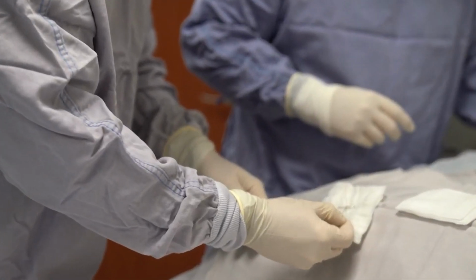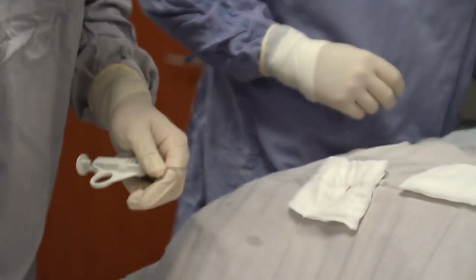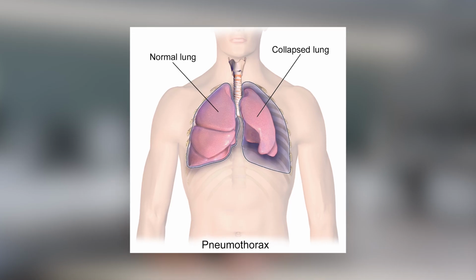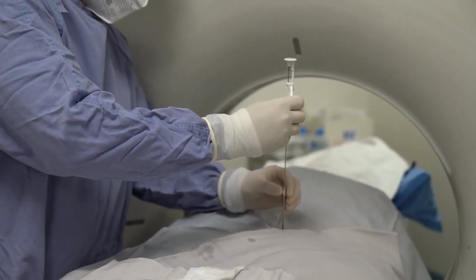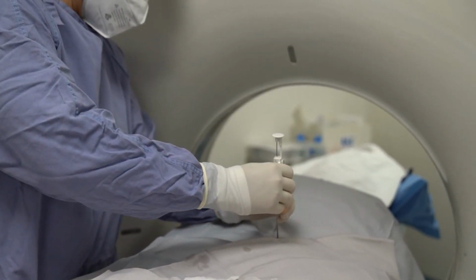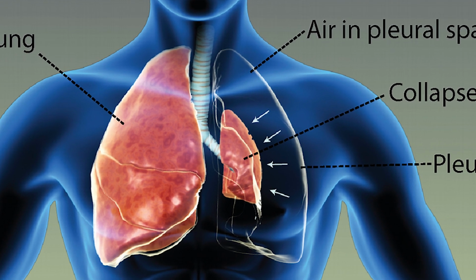So what are the possible complications? Yeah, of course there are complications associated with this procedure, although cryoablation is very safe when performed by experienced interventional radiologists. The most common complication, like a lung biopsy, is the risk of a pneumothorax or a lung collapse. And any time that you put a needle in the lung and you take the needle out, some air can escape from the lung and get trapped between the lung and the chest wall. And if you had a lung biopsy or you heard about it, you are very familiar with this process.